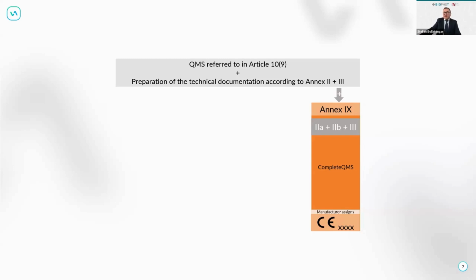You can use the software in a clinical workflow if it is, as you say, patient data segmentation or modeling, so it is not for viewing patient data regularly, then yes. If it is not used for a certain patient, or for taking or creating additional information for a diagnosis or a therapeutic decision, then yes, it can be done with non-medical software. Then the software will work for a workflow like organization of the patient, organization of patient data, and organization of the workflow internally in the clinic.